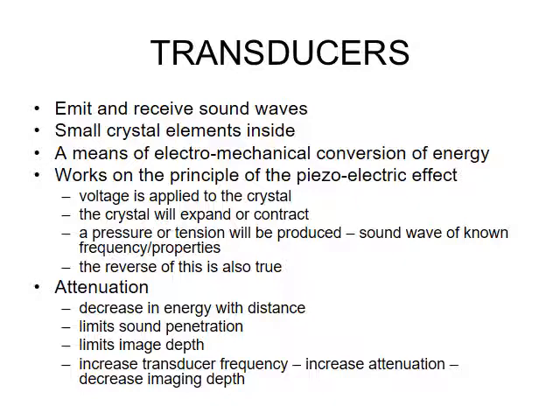So we're going to talk about the two main types of transducers, but just be aware that there are a lot more. And it really depends where you're working and what type of work is being done on that ultrasound machine as to what transducers they will have purchased and will be sitting in the room. So the transducer is really the worker. It's the thing that sends out the sound and listens for the echo and detects the echo coming back.